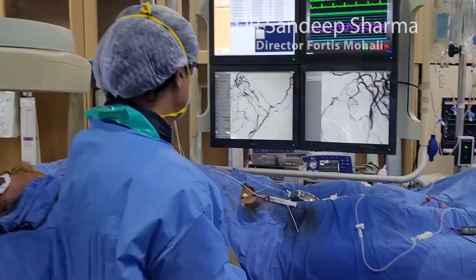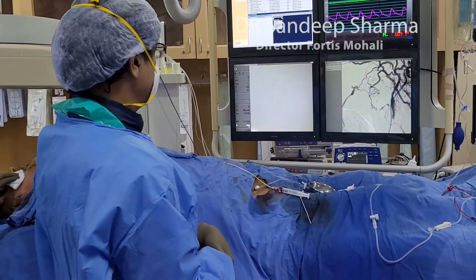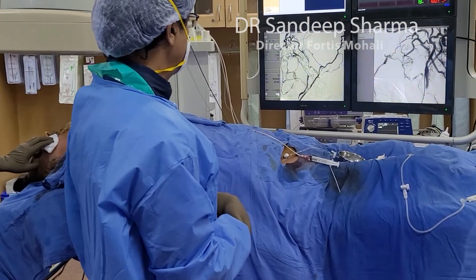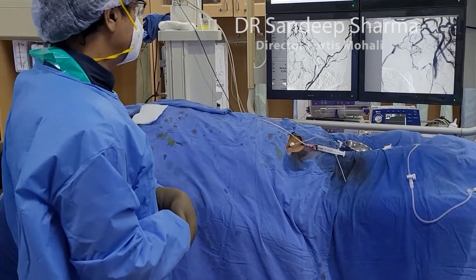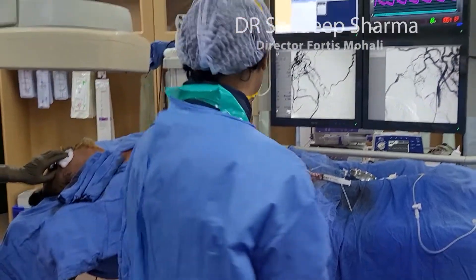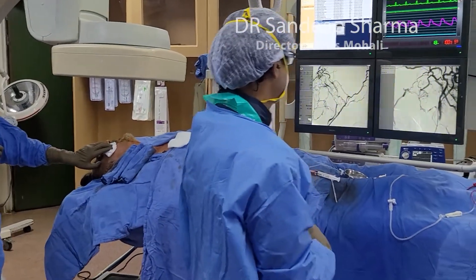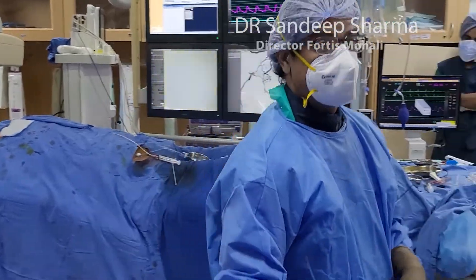The angular vein is clear, nothing much there. There are two overlapping superior ophthalmic veins — coils are in one of them, the right one. I'll remove the sheath now and finish the procedure.